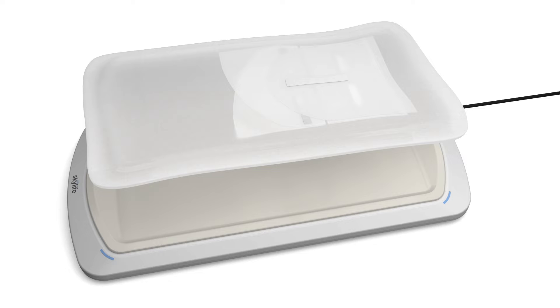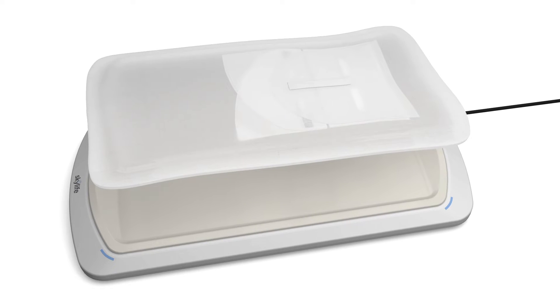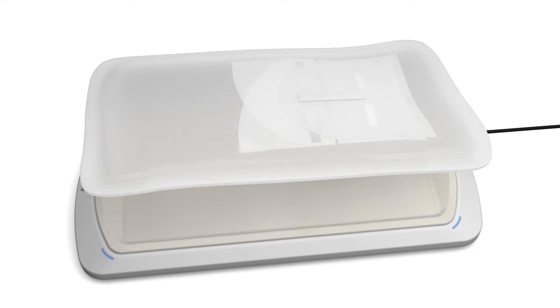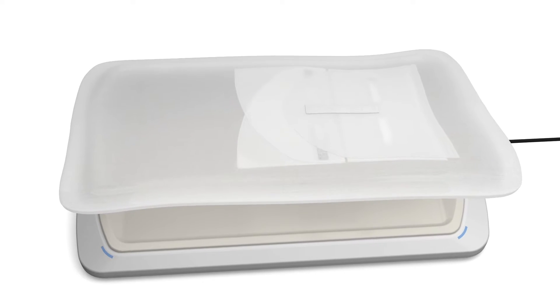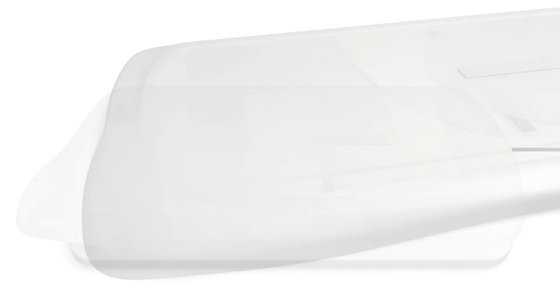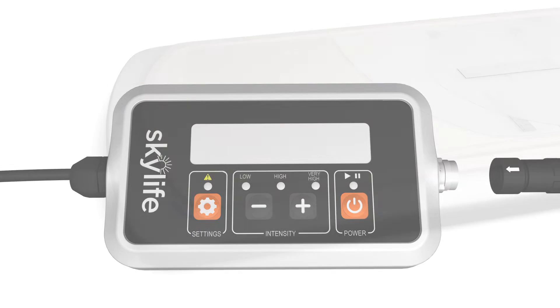We will now walk through each of the steps to effectively use the SkyLife system. Make sure the SkyLife phototherapy system is facing up with the gel pad on top. Place the Cloud Cover on the device over the gel mat. Secure the Cloud Cover Plus to the device using the corner pockets like a fitted sheet. Neolite recommends replacing the covers every 24 hours.